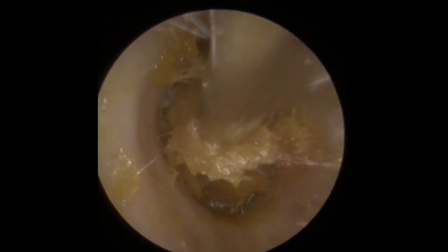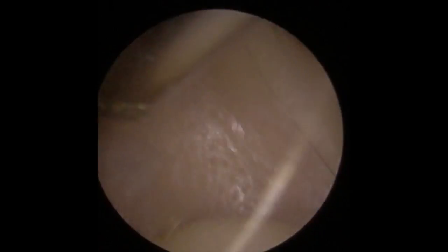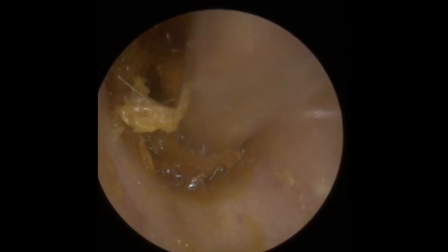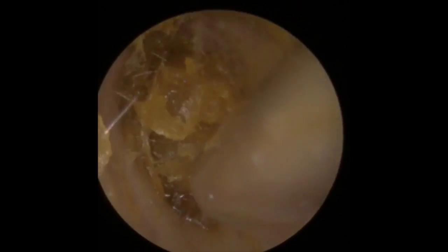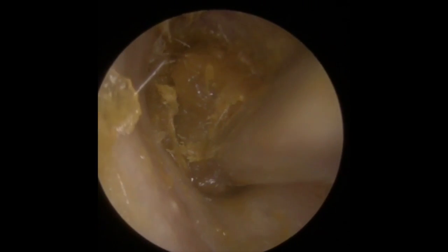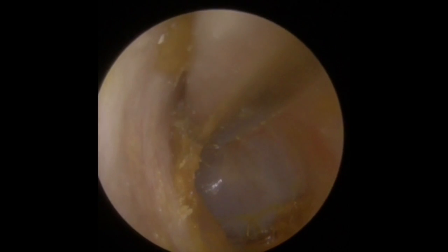Sitting just in front of the eardrum, you can see that this wax was actually one continuous piece and it's backed all the way down to the drum itself. Just gently taking away these pieces now, lifting and bringing the wax forwards. Trying to get a good grip on the bottom — it's all come away. There's a little bit up in what they call the attic region, the top portion of the canal.